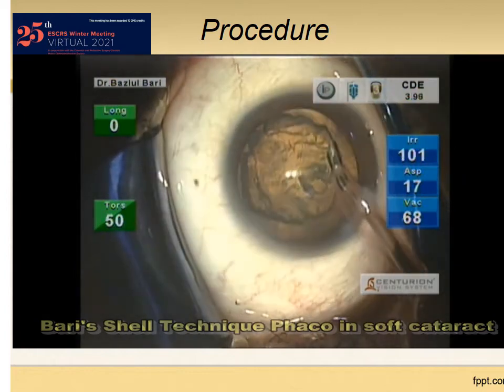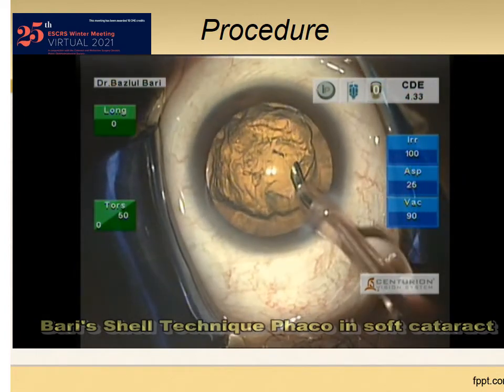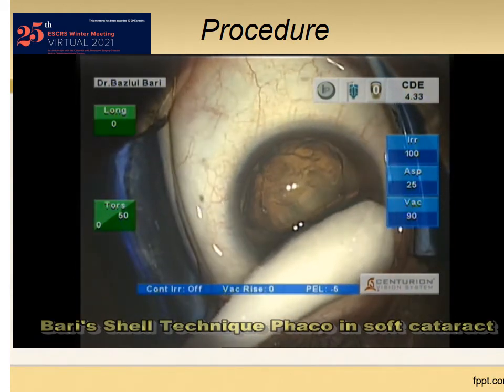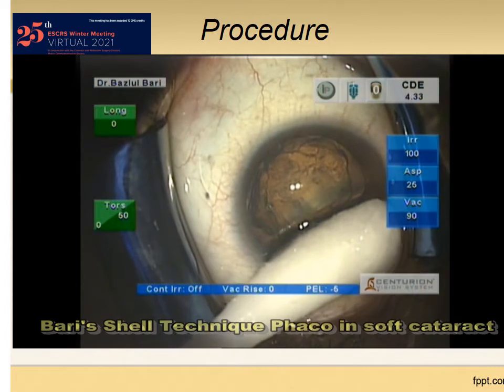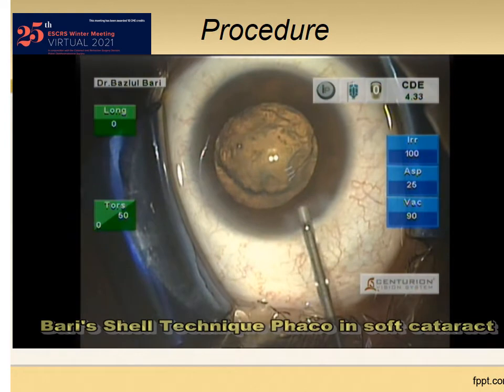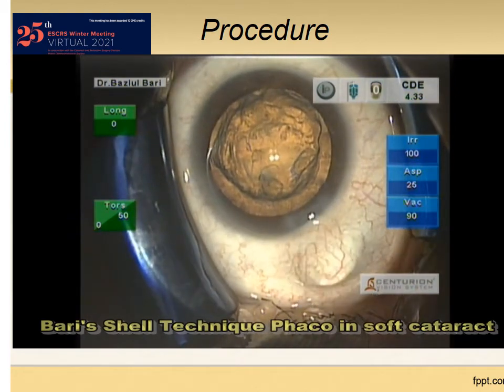Separation of the core nucleus from the epinucleus and prolapse into the free space that we created is very important in my technique. The shell will be created by pushing through at the junction of core nucleus and epinucleus, which is clearly visible now.